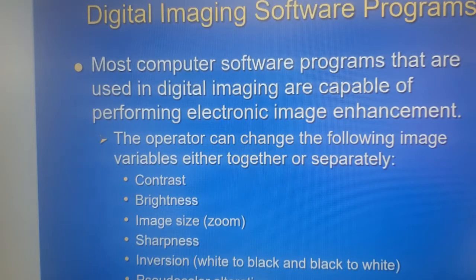From there, most computer software programs that are used in digital imaging are capable of performing electronic imaging enhancement. We may use this enhancement in situations where we want to view a particular region of a tooth or teeth in much more detail, in greater magnification. In such situations, we would make use of electronic imaging enhancement just to make sure that our diagnosis is correct, so that we can then manage the patient in a more correct fashion. That's why we make use of electronic imaging enhancement.